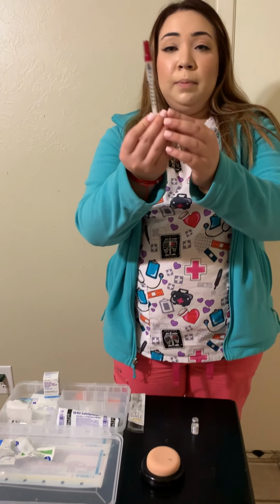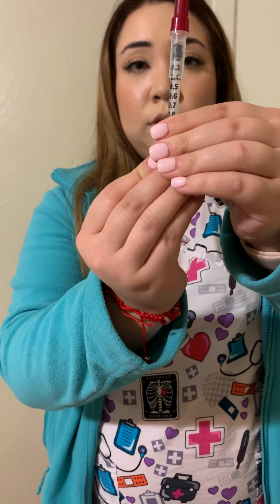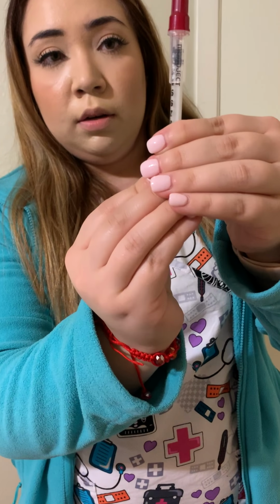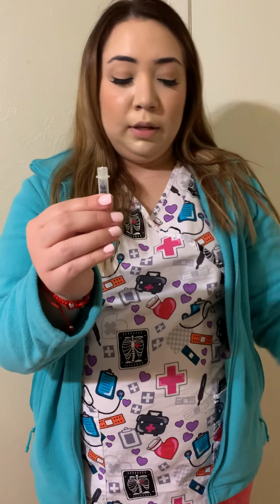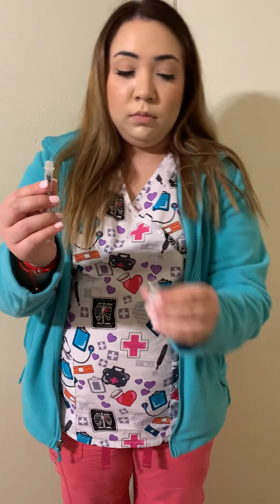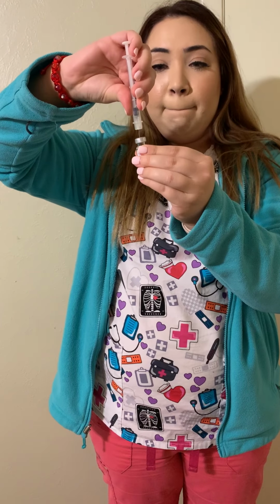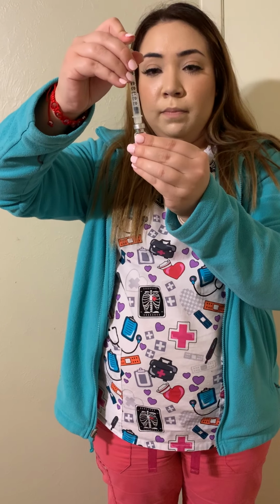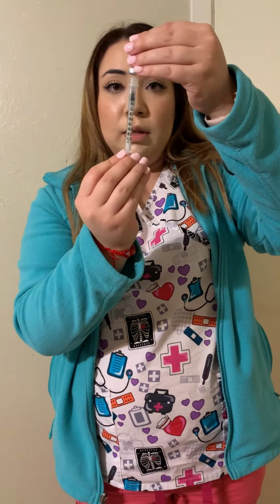So with this, our syringe is numbered. So we're going to drop back to 0.1 mLs. We're just drawing back the air. We're going to then uncap the needle. Then we're going to insert the needle into the vial. Inject the air. Flip the vial with the needle inside.